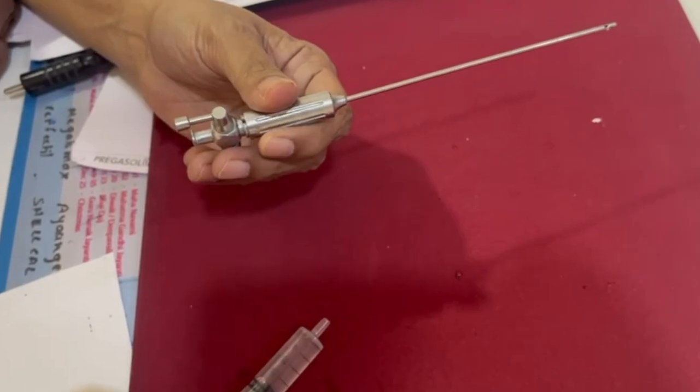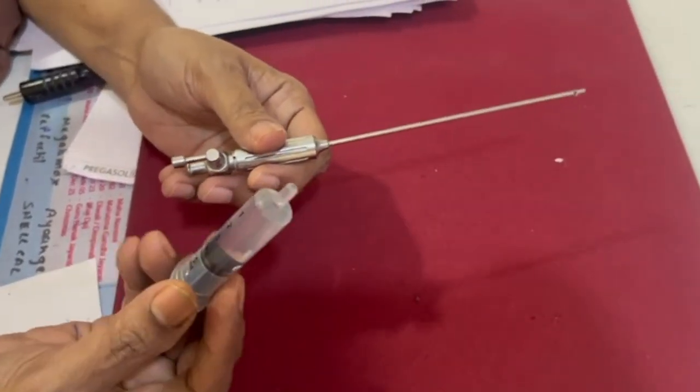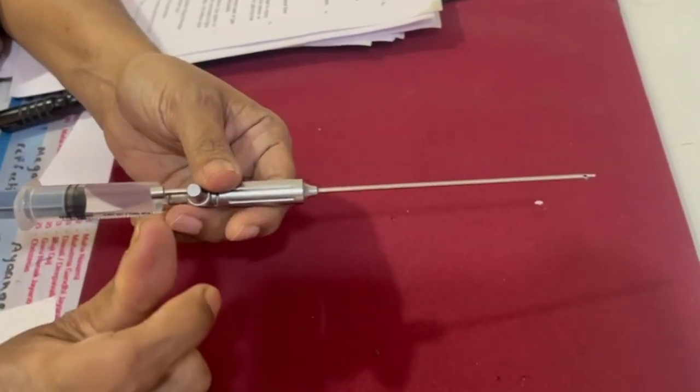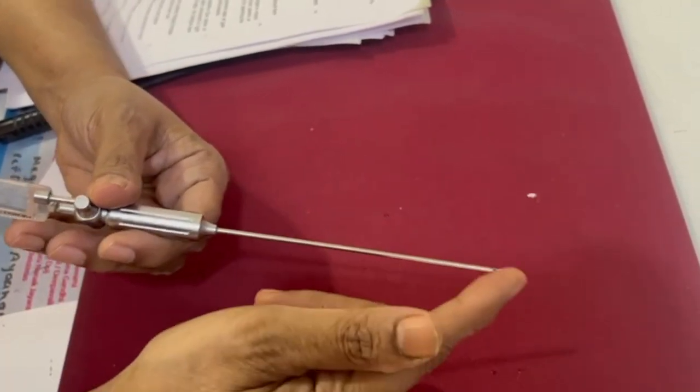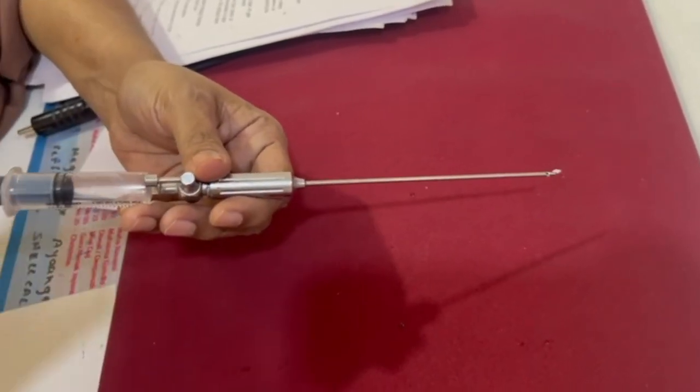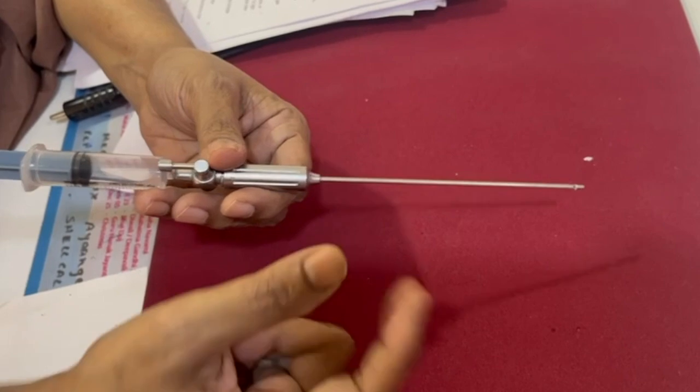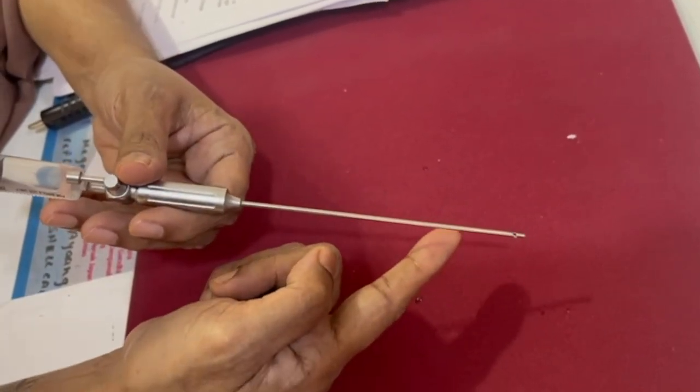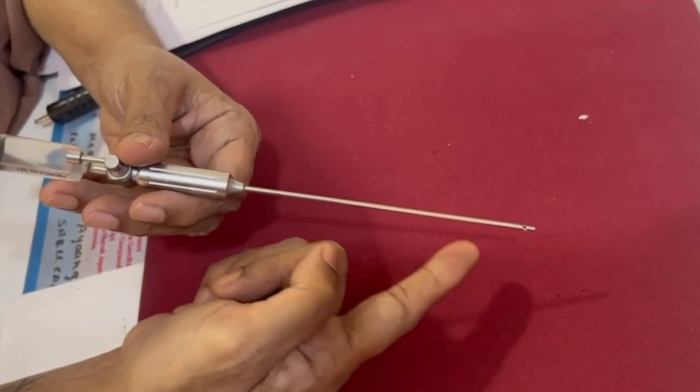Second is the aspiration test. 5 ml of saline is taken and you attach to the hub and you inject it. There will be a free flow of saline, and when you aspirate you will not be able to aspirate if the Veress needle is placed successfully in the peritoneal cavity.